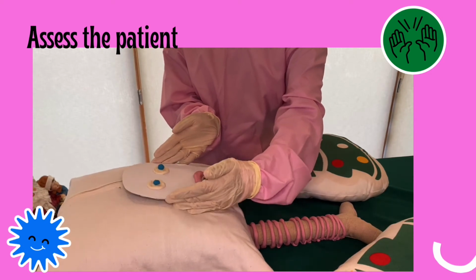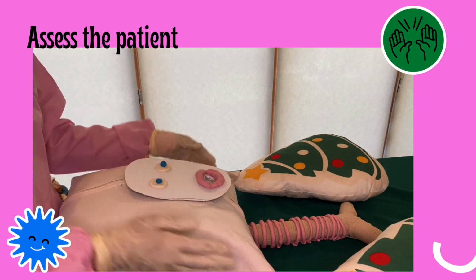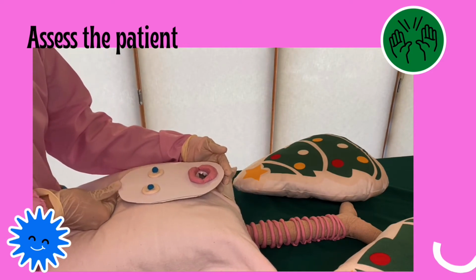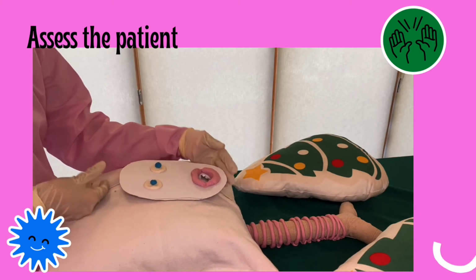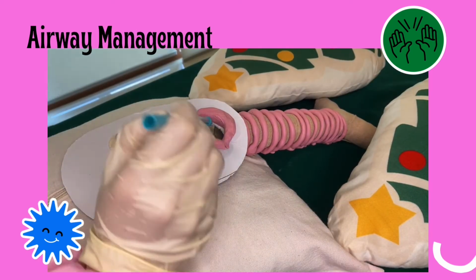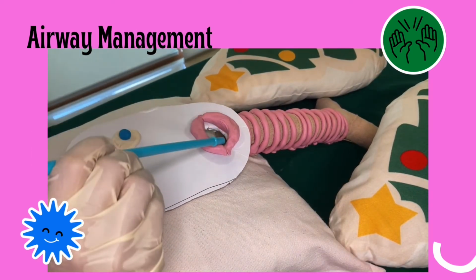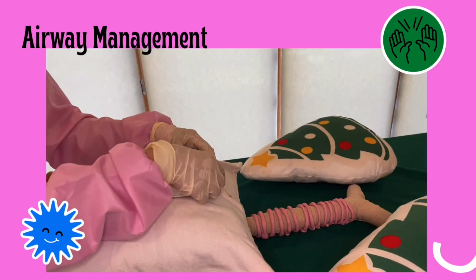The ideal position for laryngoscopy is the sniffing position, which is 35 degrees of cervical flexion and atlanto-occipital extension, aligning the line of sight from the mouth to the larynx. Obese patients require elevation of the shoulder to have adequate cervical flexion. Pre-oxygenation before general anesthesia is recommended. Suction secretions present and insert an oropharyngeal airway to facilitate adequate ventilation.